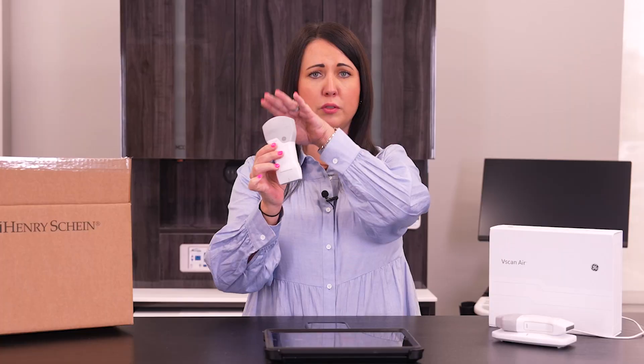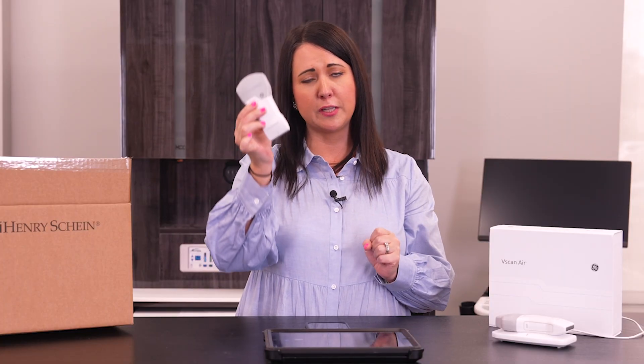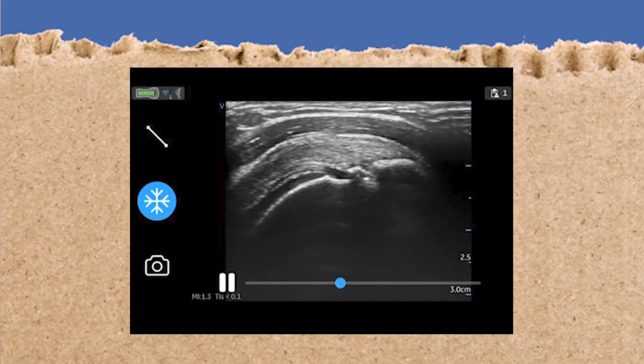We are looking at a cine loop of the heart, and this is a really good example of the image quality you're gonna get when using this SL. The CL is the best probe for musculoskeletal imaging — you can use it for deep imaging for something like a hip, or shallow imaging for something like a shoulder. We're looking at a supraspinatus tendon on the shoulder and you can see any kind of disruption in the body. You're gonna get really good image quality on this probe.